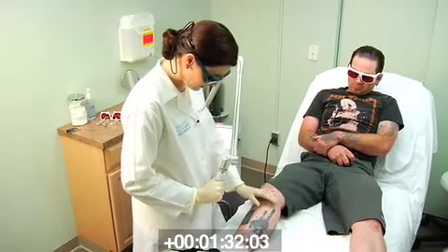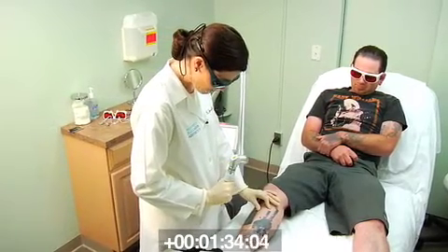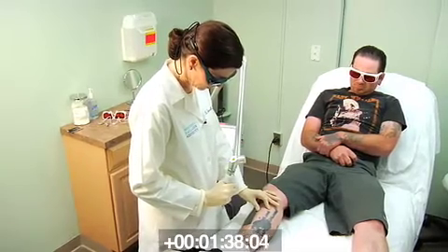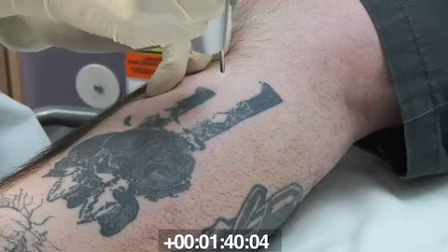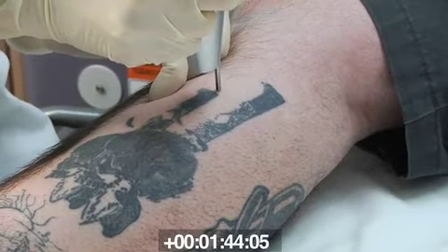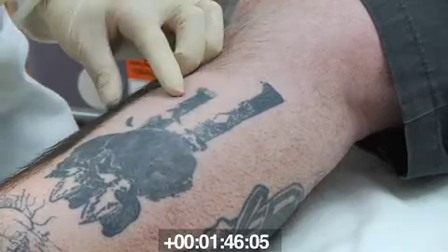I'm going to wait for the beep for the laser to tell me it's ready to go. And I'm going to do another test spot adjacent to the first. 3, 2, 1. That's better.